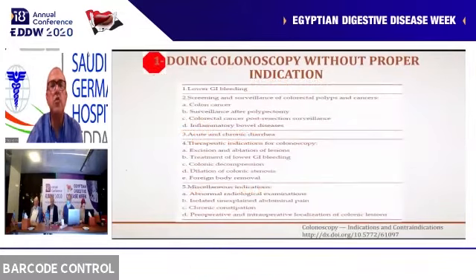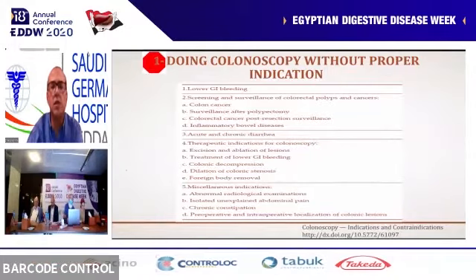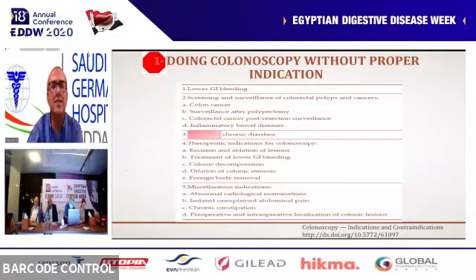You should have a proper indication for colonoscopy. The list is long, including diagnostic and therapeutic procedures, for screening and surveillance of malignancy, for diarrhea. But importantly, endoscopy should not be done for acute diarrhea because it's expected to be infectious in most of the cases, unless you expect pseudomembranous colitis. As well as in cases with IBS, if below the age of screening, if it's hardly diagnosed, it is not justified to go for colonoscopy only for abdominal pain or chronic constipation.